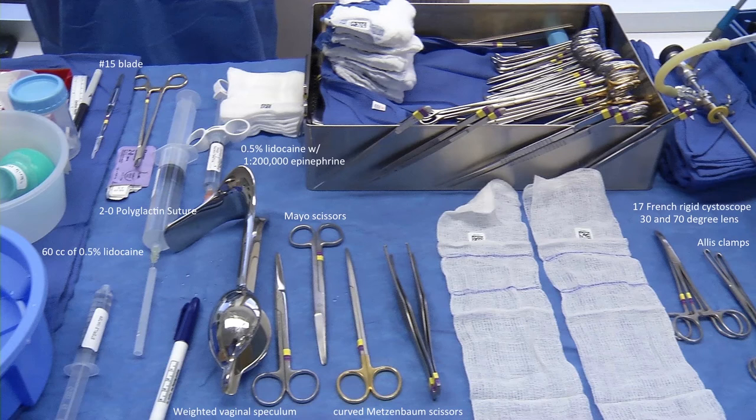Also required: 60 cc's of 0.5% lidocaine for suprapubic incisions and retropubic hydrodissection, 0.5% lidocaine with 1 in 200,000 epinephrine for the vaginal incision, 2-O polyglactin suture, benzoin and Steri-Strips, retropubic sling trocars with attachable trocar handles, a polypropylene mesh mid-urethral sling, and an 18 French Foley catheter with a straight catheter guide.